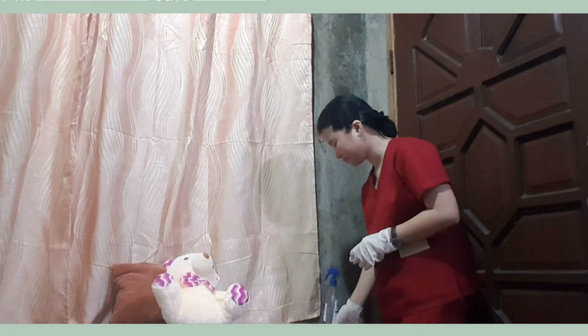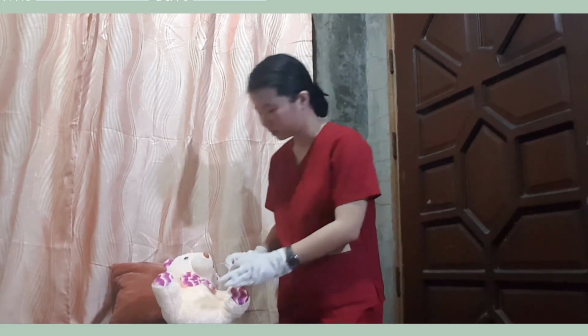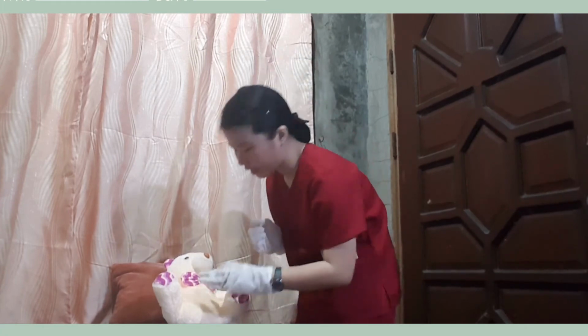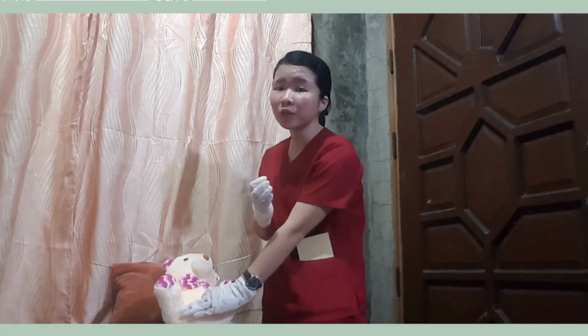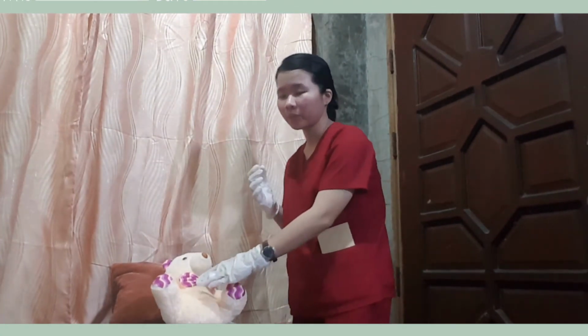And let it dry. And after that, you're going to pinch the site with the non-dominant hand and insert a cotton between the third and fourth finger. This is to ensure safety and reduce anxiety for the patient. The cotton is on the third and fourth finger. Now we're going to pinch the site.